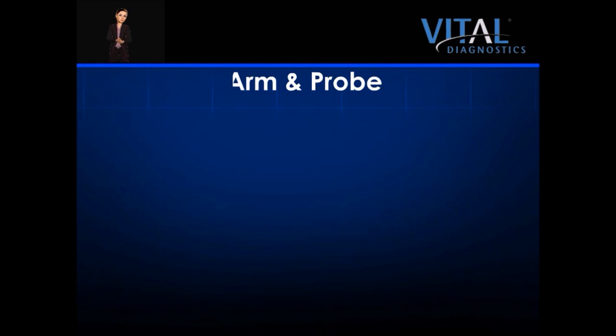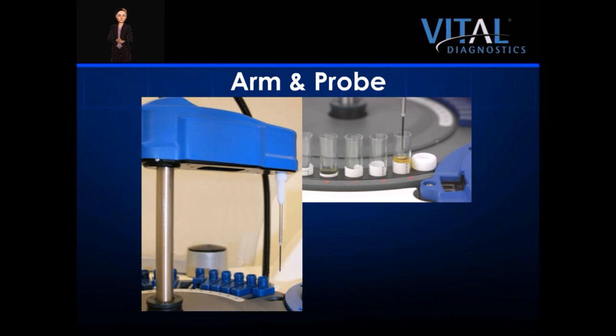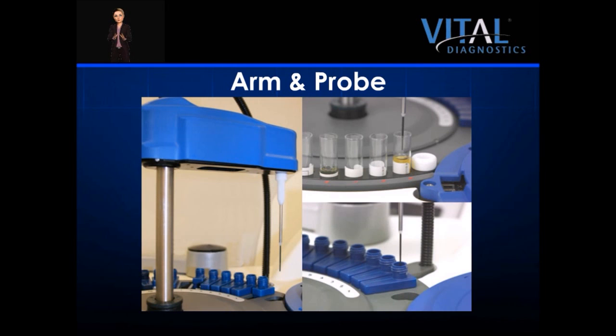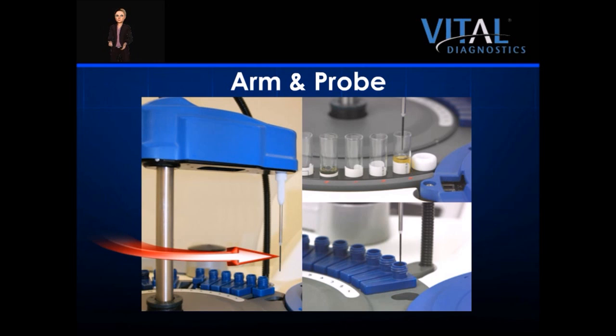The EON100 utilizes a single robust arm and probe for all of its pipetting needs. The unit features liquid level sensing, which is important in determining if a sample is adequately available and for the on-board reagent volume tracking feature. The probe is spring-loaded with a sensor that stops it when it meets an obstruction, preventing probe damage that could lead to downtime. The probe is Teflon coated, which helps to prevent cross-contamination. The probe washes itself in a dedicated washing station. The Teflon tip and the probe washing station together eliminate the need for costly disposable pipette tips and decrease operator interaction.